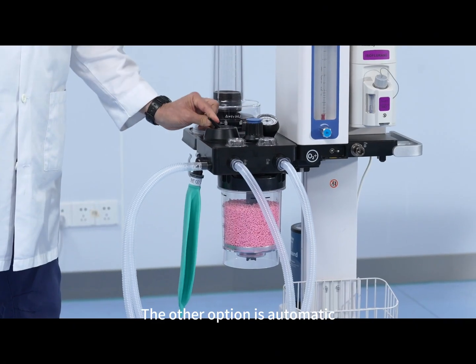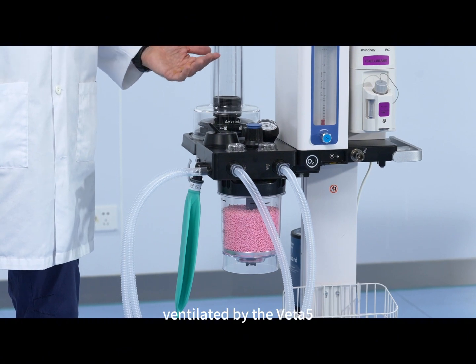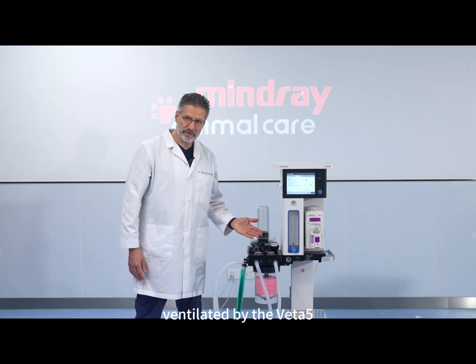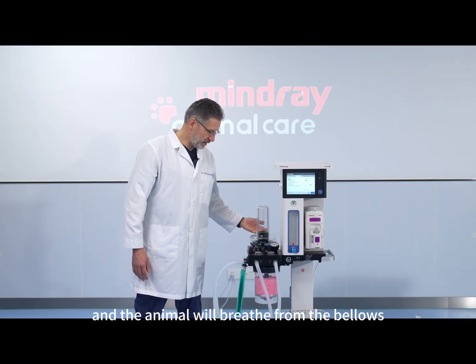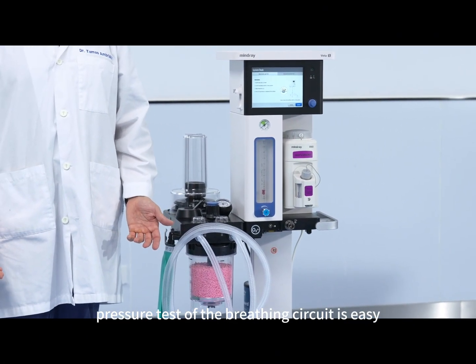The other option is automatic mode, meaning that the animal will be automatically ventilated by the VETA 5 and the animal will breathe from the bellows. The automatic pressure test of the breathing circuit is easy.